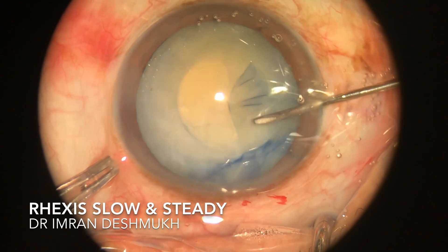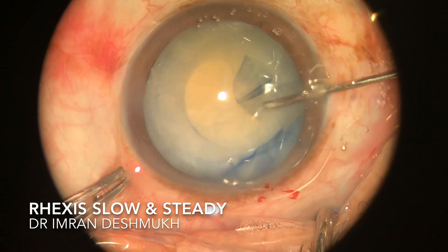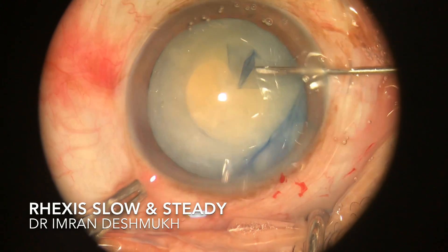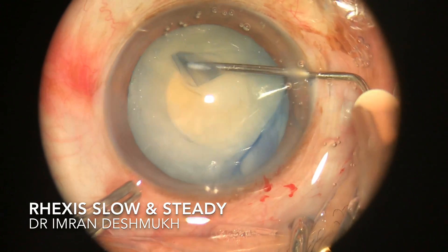Slowly drag the anterior capsule in a way that you get a round, circular rhexis of at least 5.5 mm. Don't worry if the rhexis is small because you can enlarge it later at any time. Be slow, be gentle, and take your time.